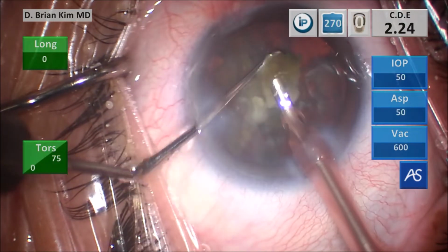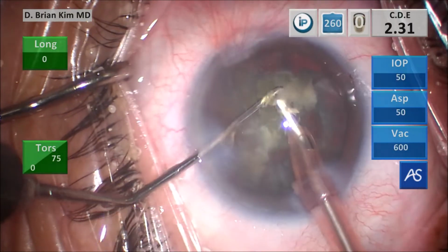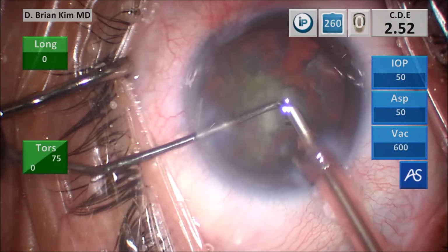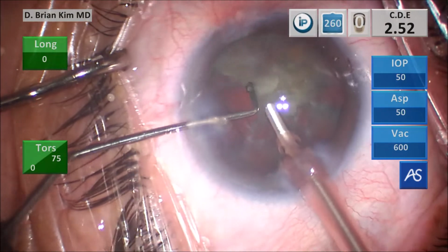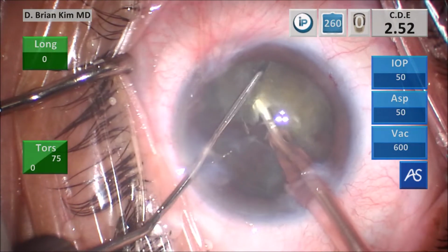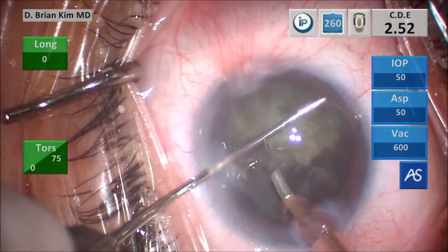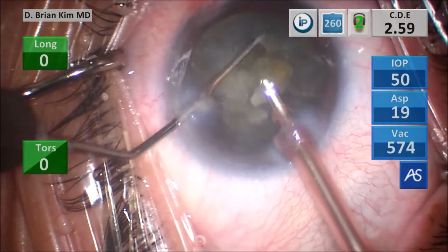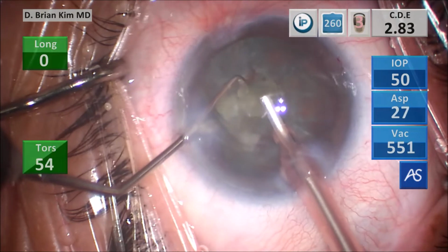Same thing with that piece there. I grab it, lift it up, crushing it with opposing forces, crushing it between the instruments, and then emulsifying the lens piece. This is the last quadrant, placing the chopper around the lens at the level of the equator, pulling it centrally toward the phaco tip, fracturing the lens in half. Doing the same maneuver around that fragment there, you can see that sudden loss of resistance. This is quite a dense lens, fracturing the lens piece in half, and then emulsifying the lens piece.